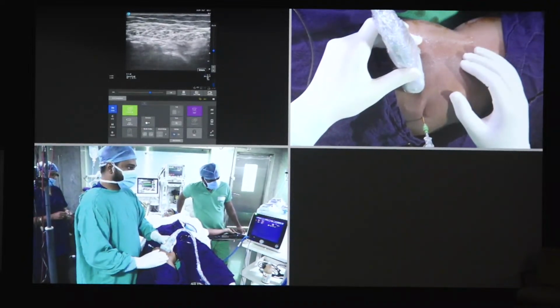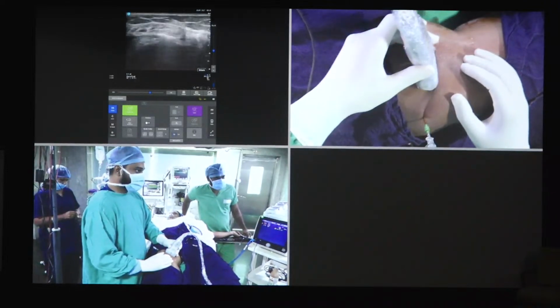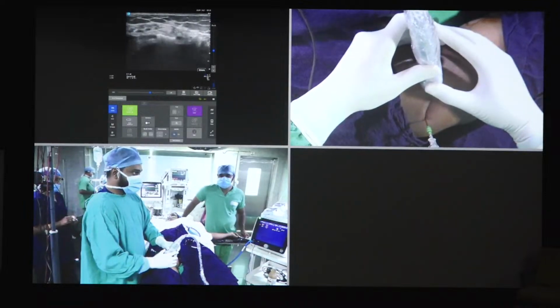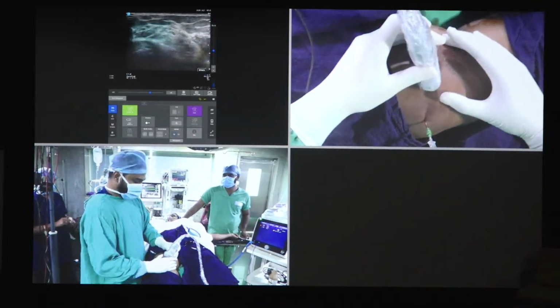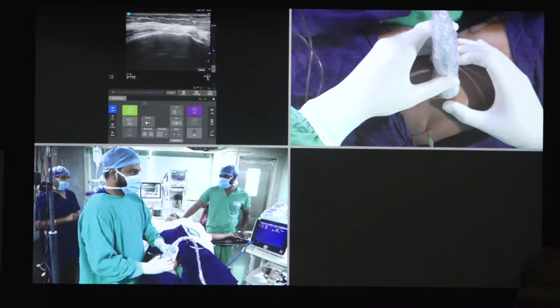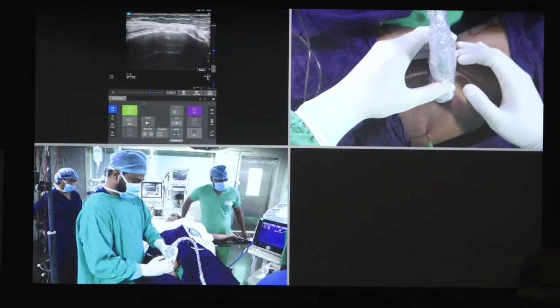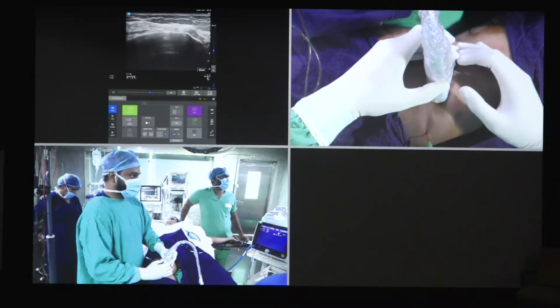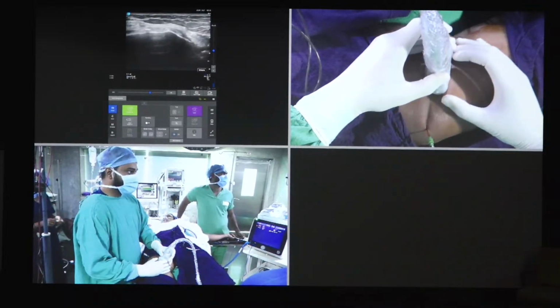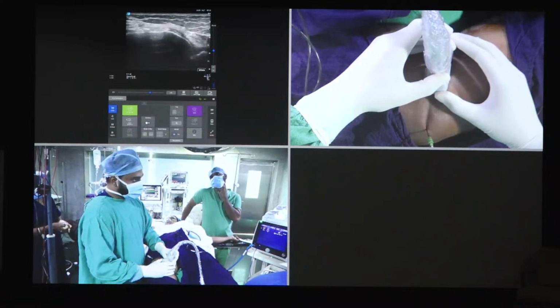So you will see the flattening of the femur bone, which is the condyle, and it becomes more superficial, and the adductor tubercle is a little more sharp, has a prominent tip. So that pointy thing that you're seeing here, exactly in the center, is the adductor tubercle, and you can see a pulsation over there.